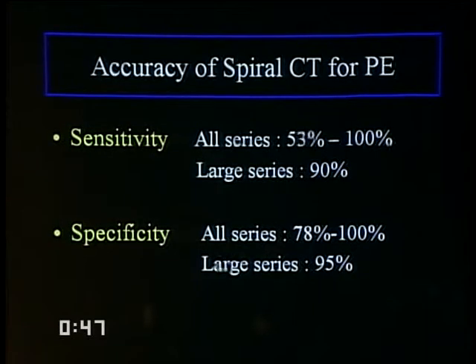And the specificity, particularly if these criteria are applied correctly, there's always potential for over-reading of CT scans, and I'll come back to that. I think it's very important that we adhere to strict criteria. If it's not diagnostic, we call it non-diagnostic. But if it is diagnostic and we adhere to those criteria, if we call a pulmonary embolus, the clinician can be certain it is a real embolus.